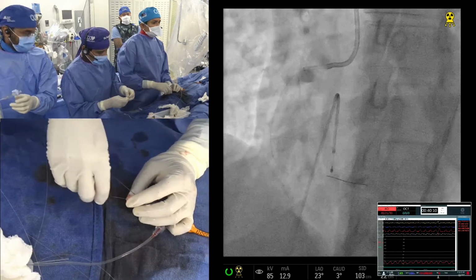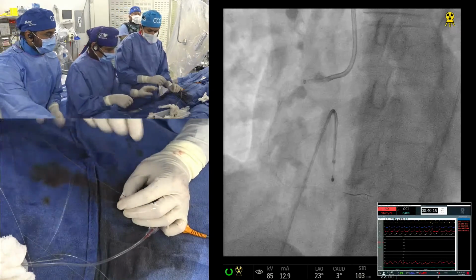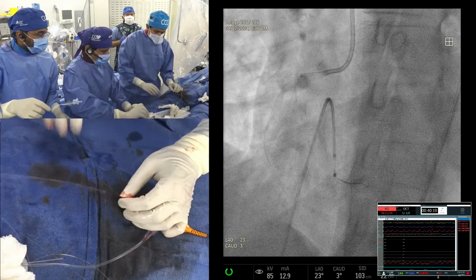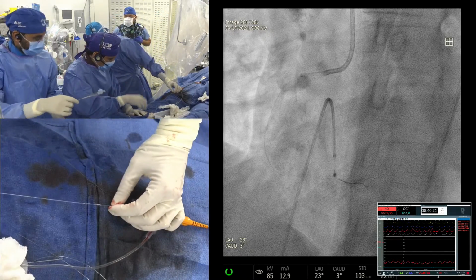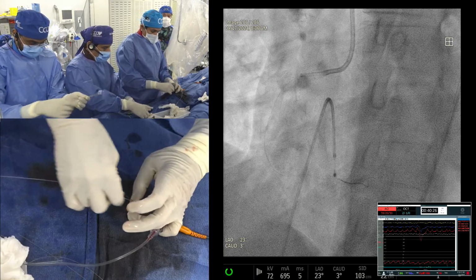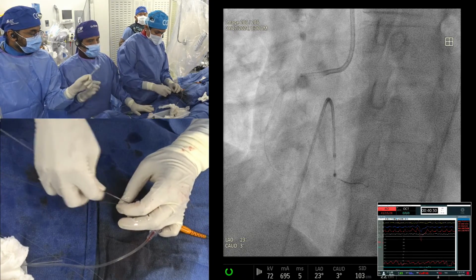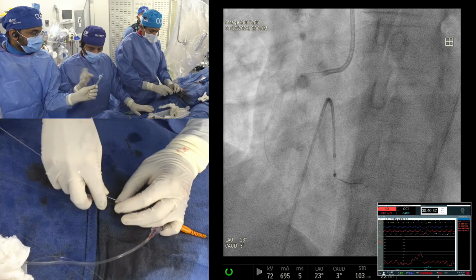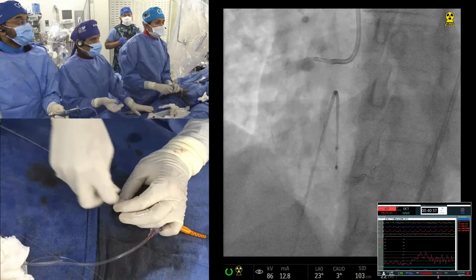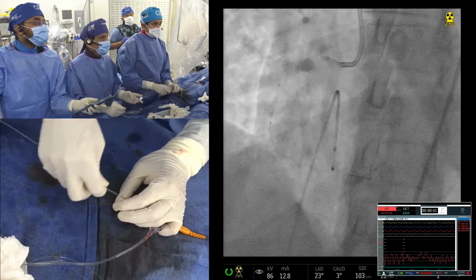When we were presenting this case, people felt that it's a simple case. I said no. I knew this case would be tremendous, just because of the degree of calcium, and that is why I think it's a classical case. It's not your regular type B calcification tram track. It's way beyond tram track, thick tram track. OCT showed almost 1 millimeter thickness, 1+ millimeter thickness of this calcium, but angiographically to me it looked like that also.